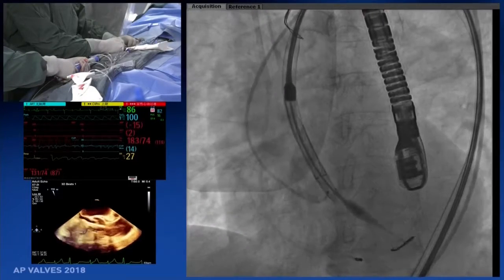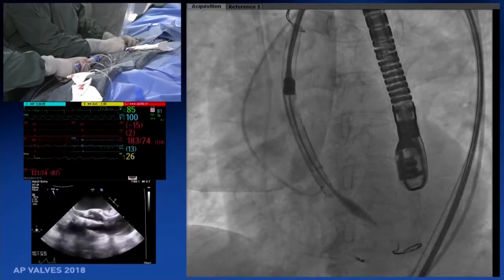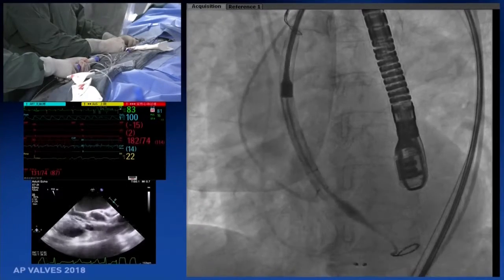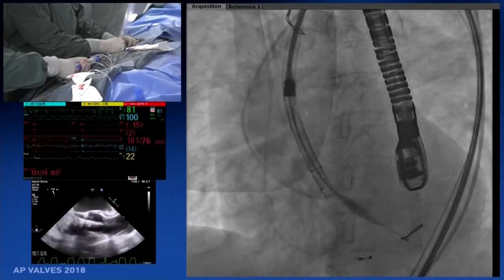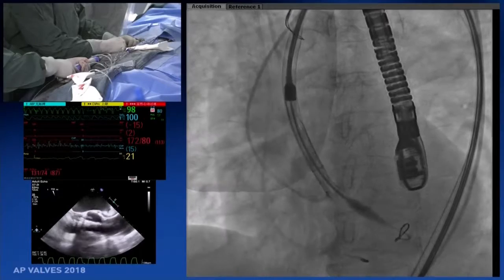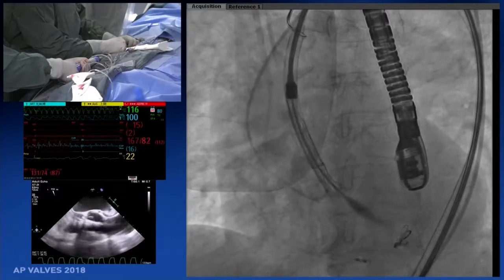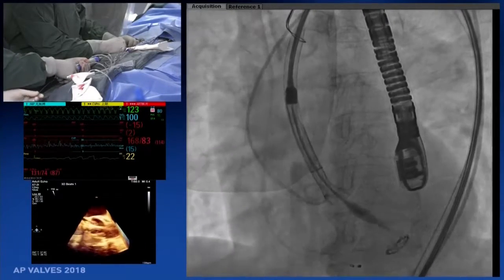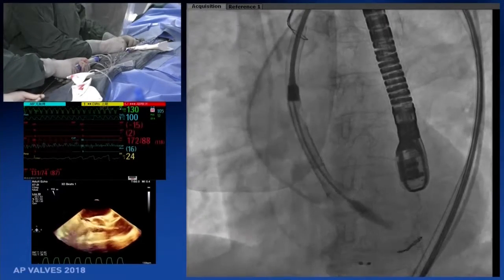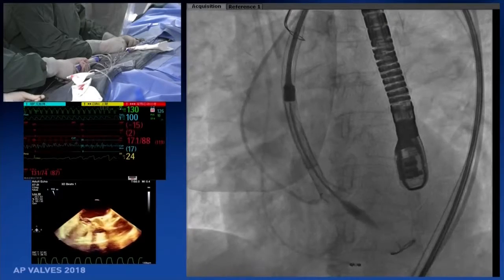I think we can start pacing. Start pacing, Qibo. 130 beats per minute. Okay. Keep on going. See that part, the high deployment, I think the high deployment is very important. Because why is it easier with the pacing, with a wiggling valve instead of? Go on. Keep on going.